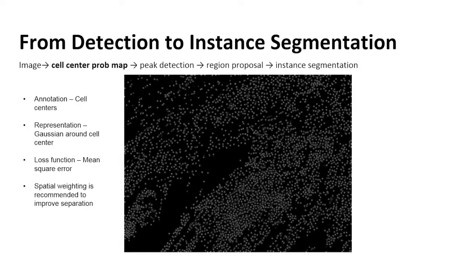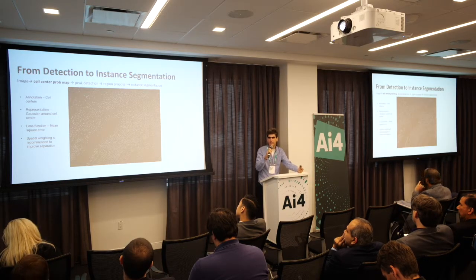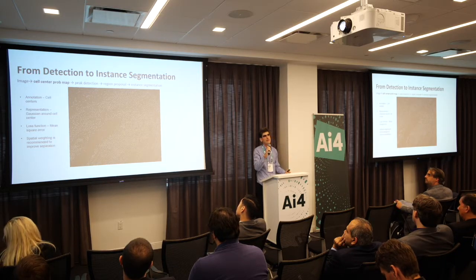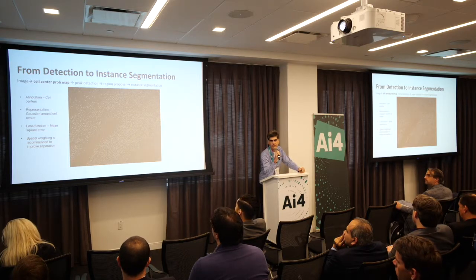You have these results, and then your annotators need to throw out the errors and mark the ones that are missed, or maybe even identify only challenging regions and annotate those by hand, and that can save a lot of time. And this is key in developing these solutions quickly and robustly. You need to choose the right way to select the loss function here and the spatial weighting. But the architecture is based on pretty well-known standard segmentation architectures.